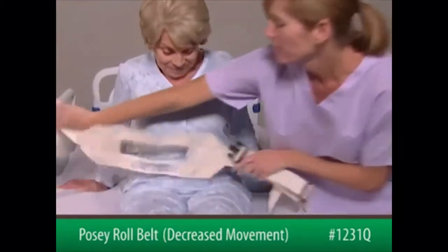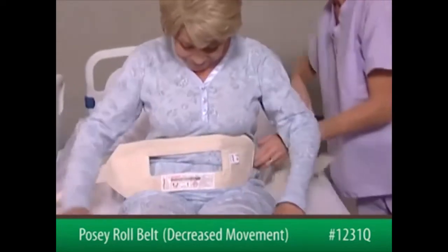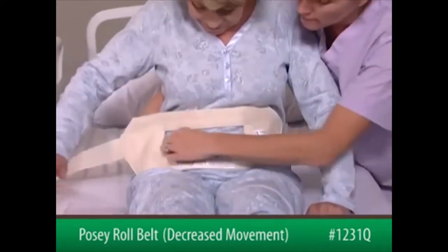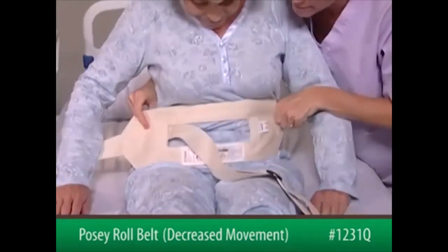Next, wrap the belt around the patient's waist with the belt slot centered in the front and the label to the outside. Bring the long strap over, around the patient's waist, and in front of the patient through the slot in the front pad.